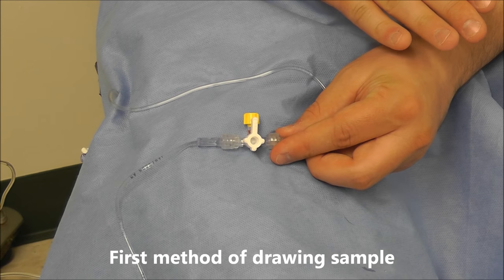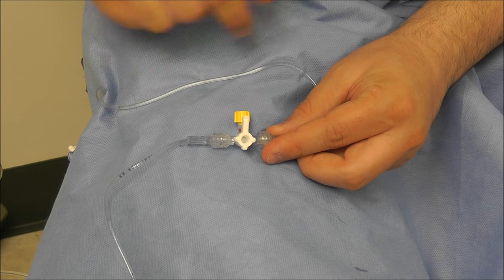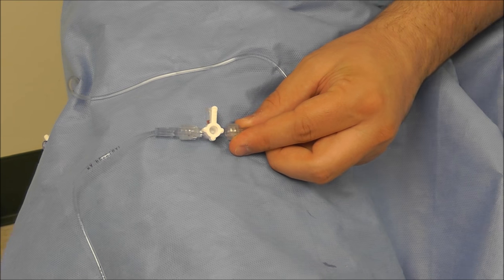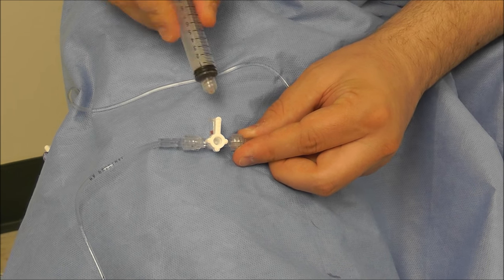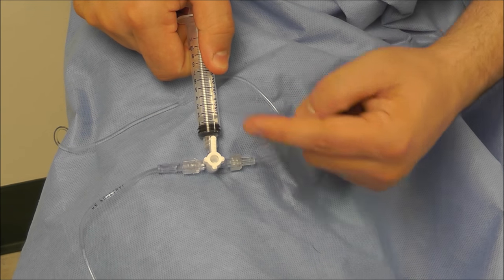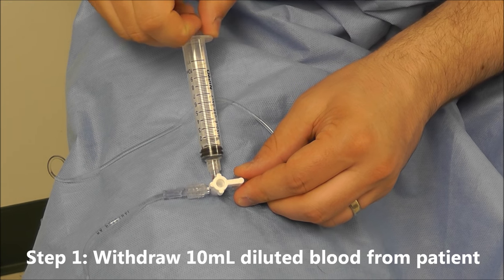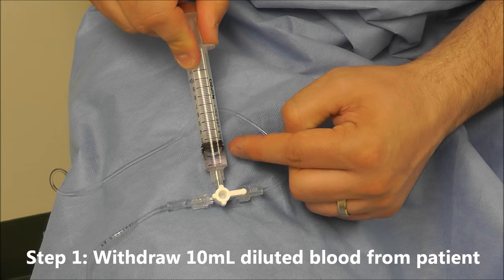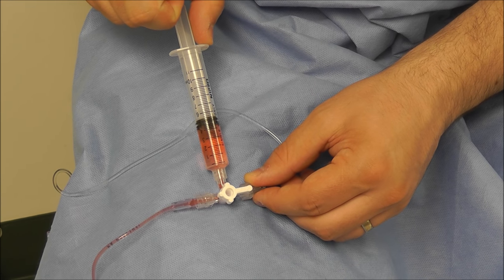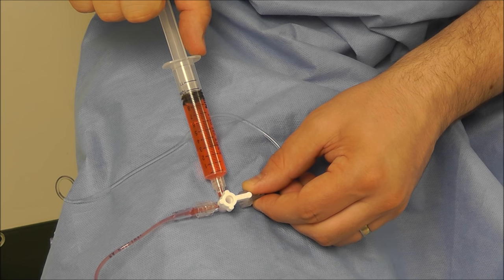The first method we can use for drawing our arterial blood from our art line is just a normal stopcock. We take the cap off, apply a 10cc syringe, and turn the stopcock off to the pressurized bag. When we withdraw our 10ccs, we can see there's saline that we're drawing back, and we want to make sure that we draw at least 10ccs so that it doesn't dilute our sample.